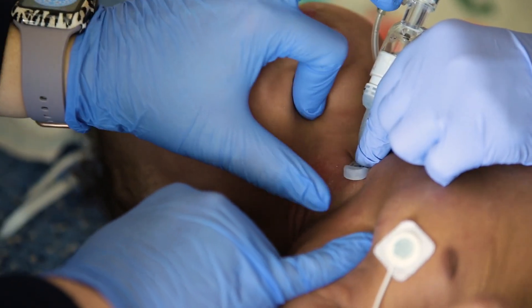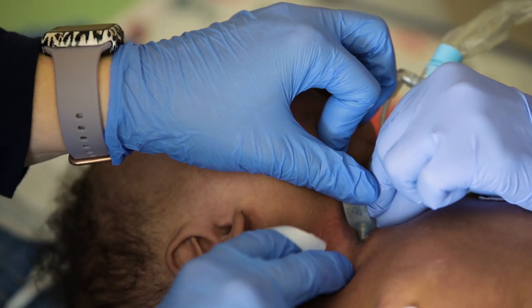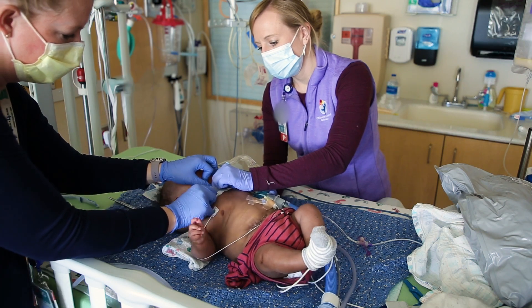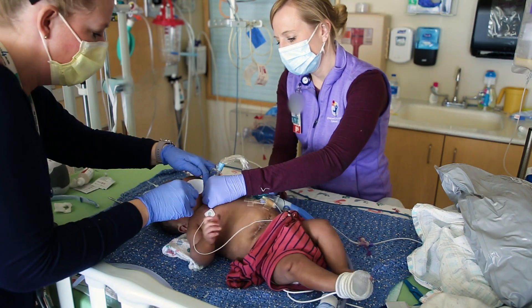If moisture or drainage sits on the skin around the trach tube or the neck, it will cause skin irritation or an infection such as a yeast or bacterial infection. You should have someone else that has been trained to help you hold the trach in place when you are doing stoma care and changing trach ties.